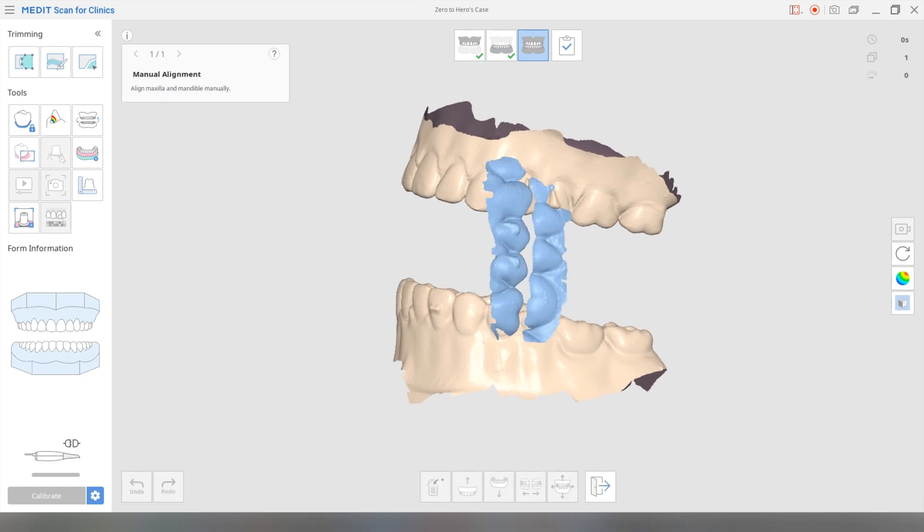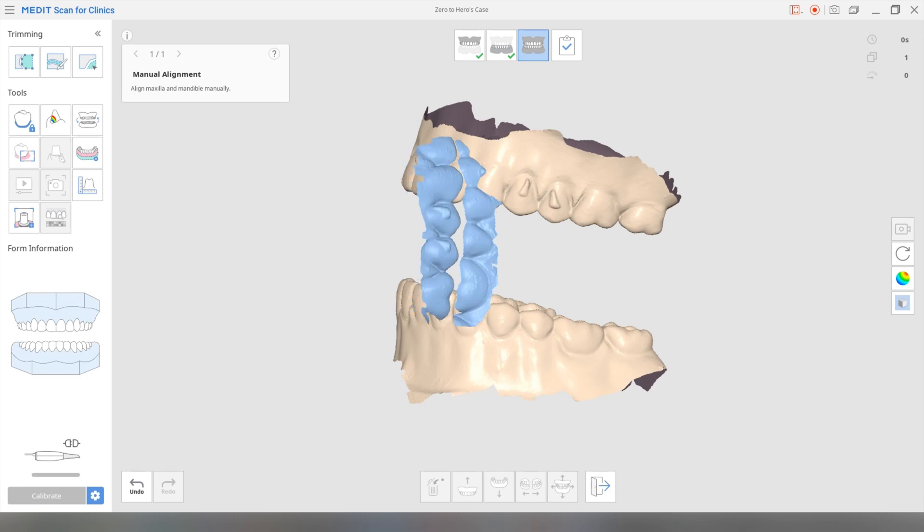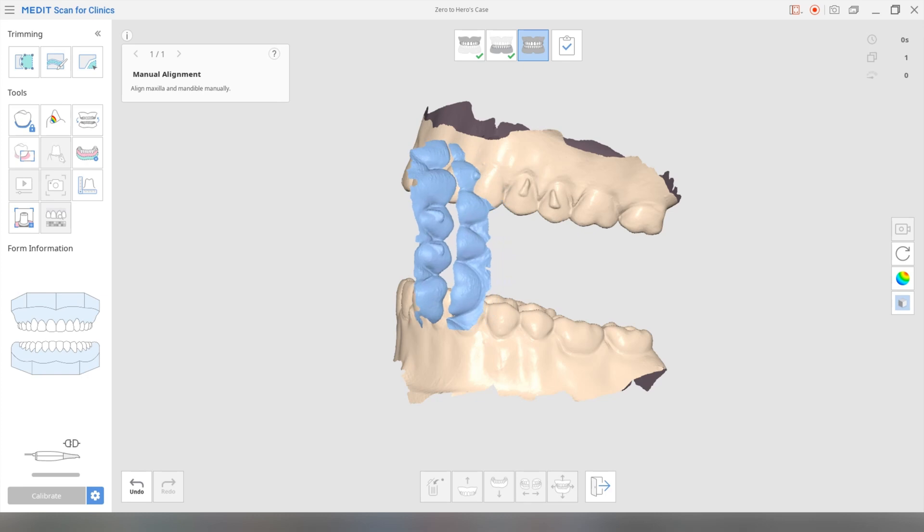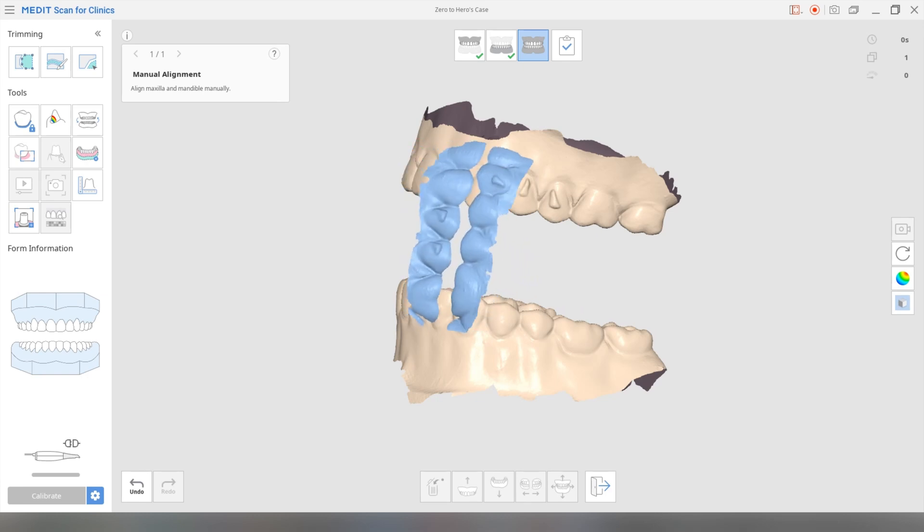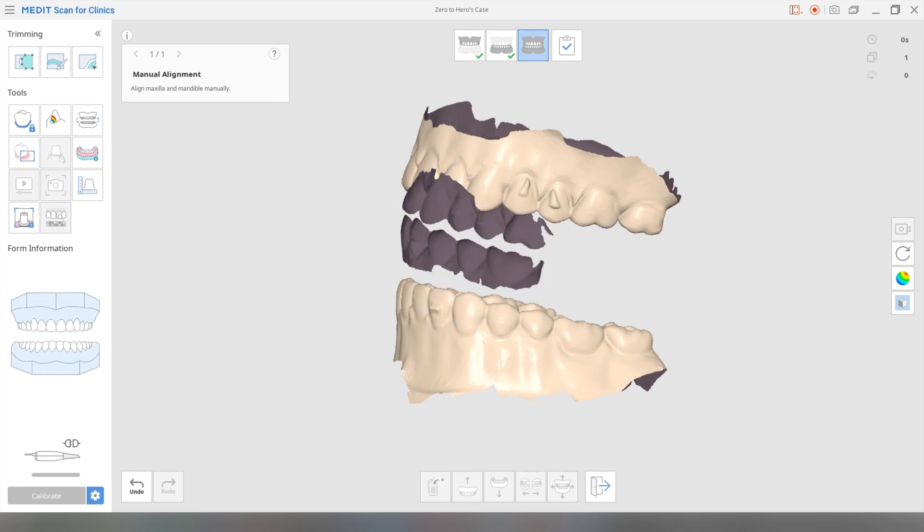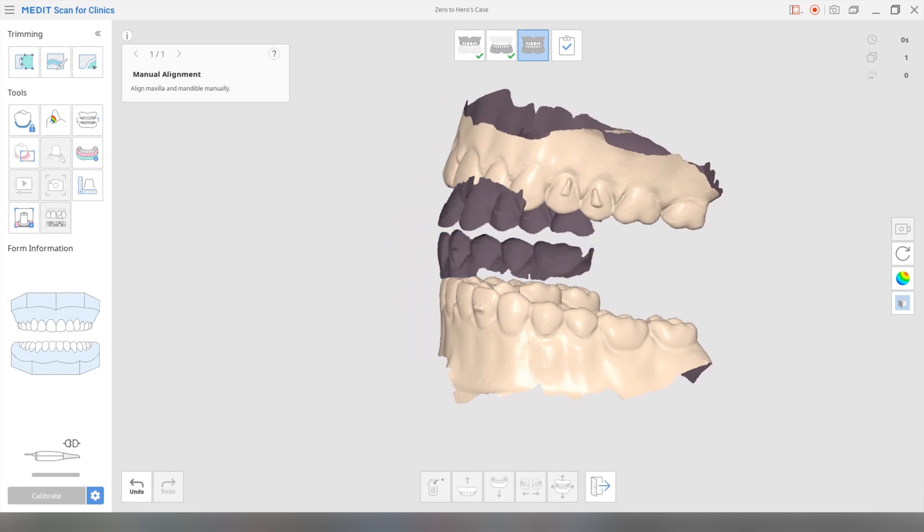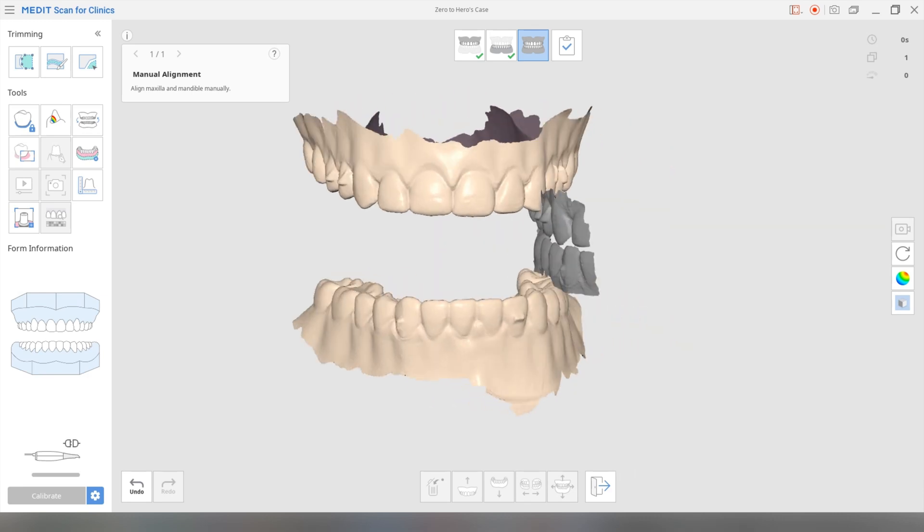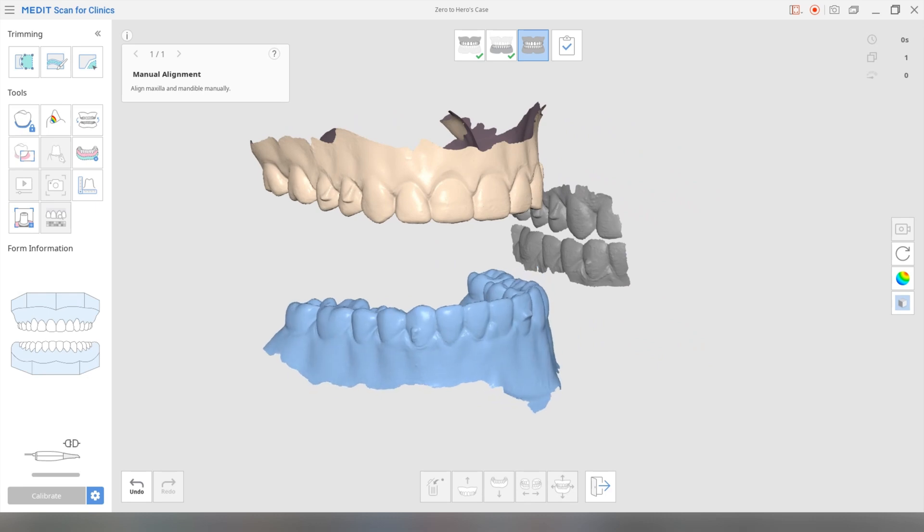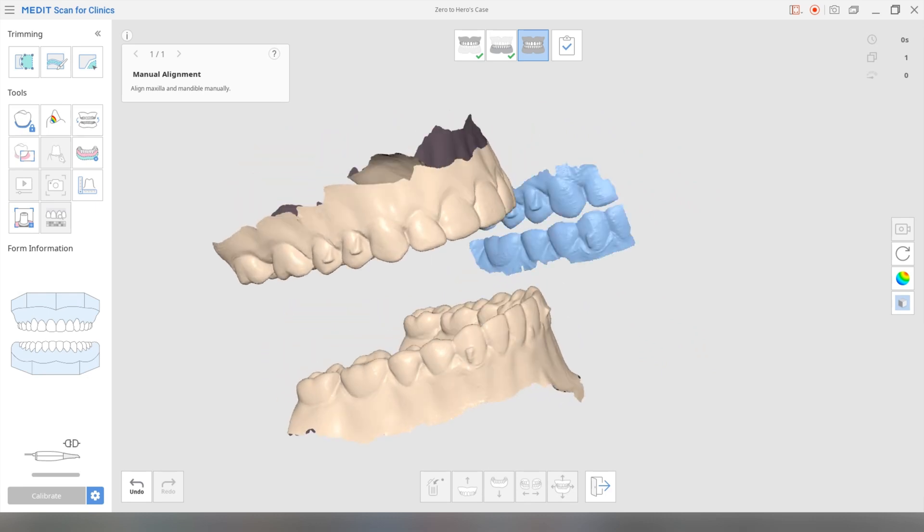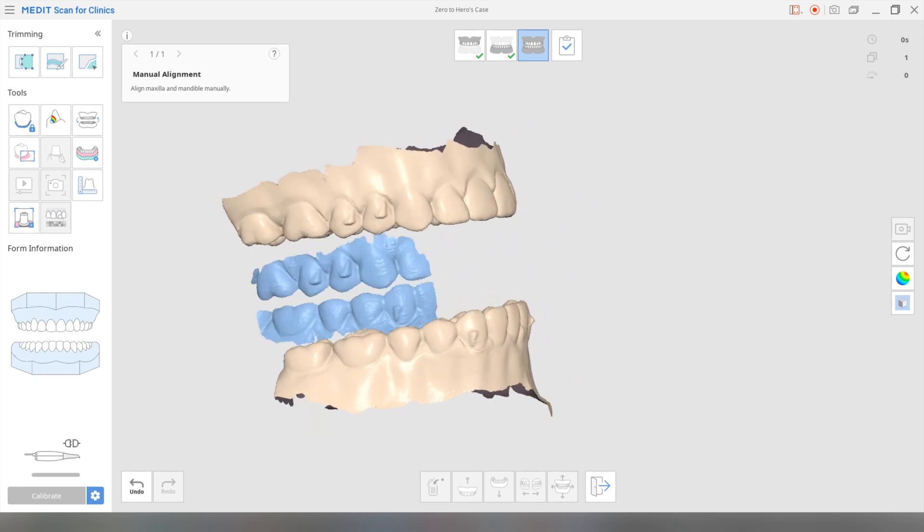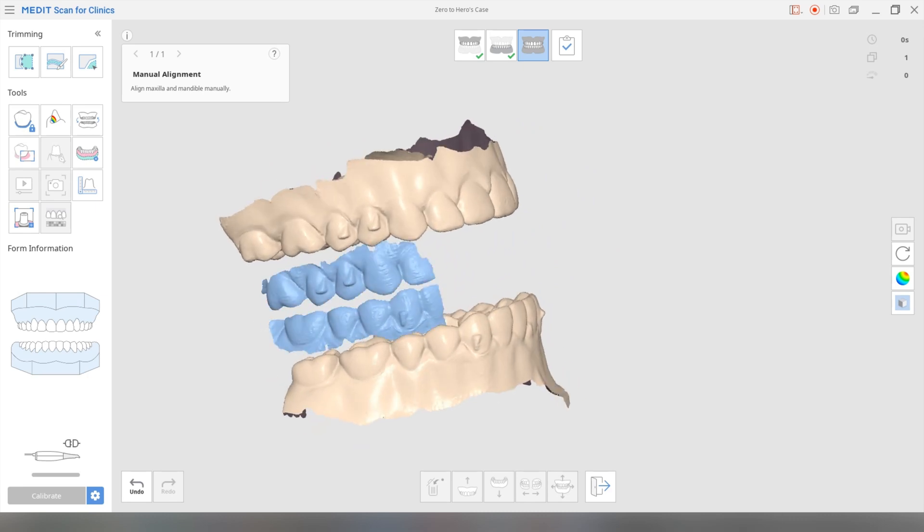So what we're going to do is we're going to manually align it. So we're going to move that over here. So basically, while your cursor is hovered, it'll turn blue. And then you can hold the scroll button to reposition or rotate. While it's positioned like that, hold the right button on your mouse to rotate it. Just so that you can see a bit easier. So that's very easy to see now.